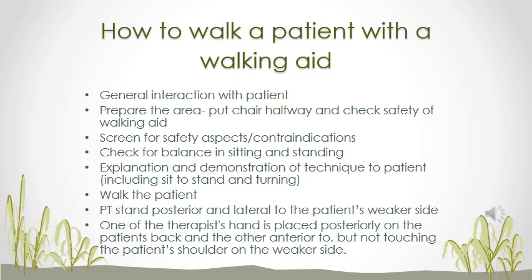Check the balance in sitting and standing. Explanation and demonstration of the technique to the patient. So teach them how to go from sit to standing with their walking aid. Will their one hand be on the chair and the other hand on both crutches? And then they stand. How will they move from standing back to sitting? Also teach them how to turn with the walking aid.